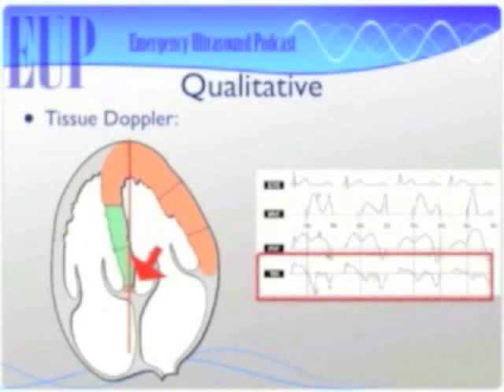So it's measuring the tissue velocity during the same E and the A. So the E and the A still stand for the same times. Correct. The E prime is just early filling and the A prime is the atrial kick. So it's the speed of the tissue descent during early filling and atrial kick. And if the E is greater than the A, then that's always going to be normal with tissue Doppler.